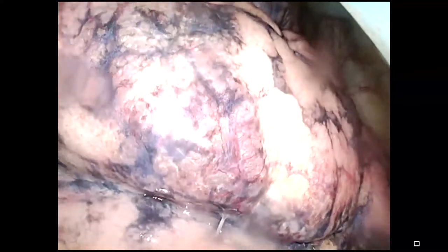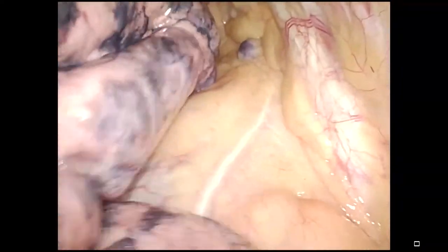Mahmoud, Diego, where exactly did you place the incision? Fourth or fifth intercostal? Fourth intercostal space.